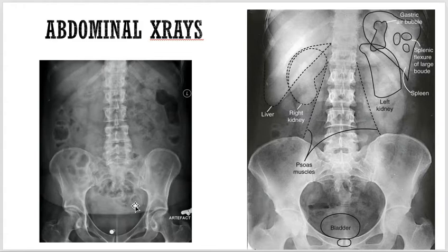So now, abdominal x-rays are also interpreted same like chest x-rays. There is no difference, especially when it's about interpretation, right? So we have to see the same thing. Either it's taken in the supine form, or they have taken it in erect form, right?